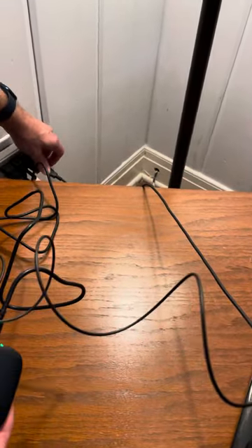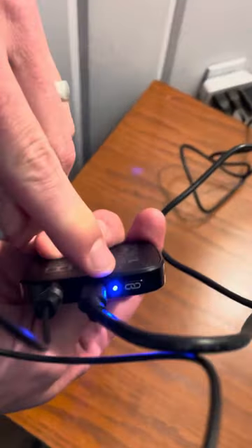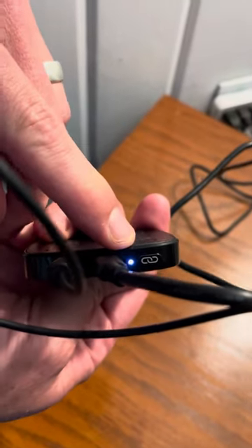You could also use the USB port on your television if a standard power source is not available. Now on the back of the unit you can see these blinking lights — and now it just went solid.